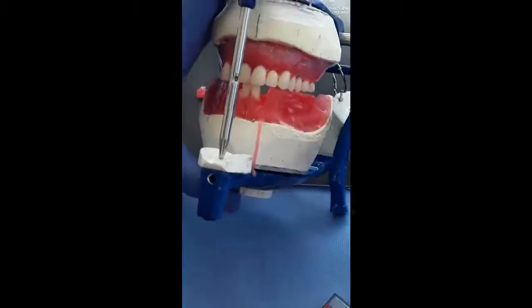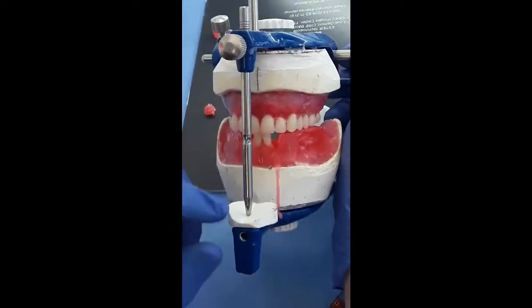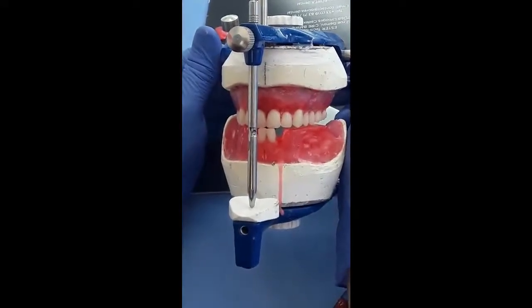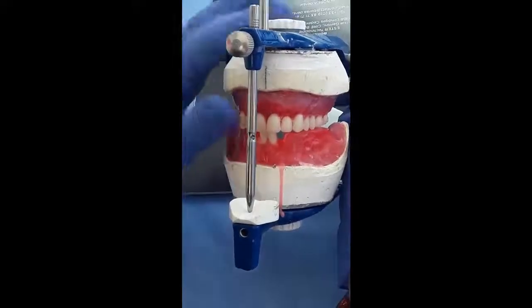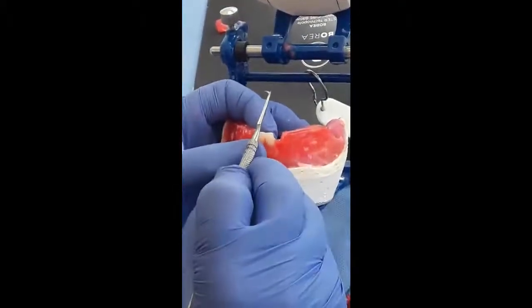Now I will examine the incisal guidance angle created by my setting, whether it is the same incisal guidance angle at the incisal guidance table. Now we need to move this a little bit downward.